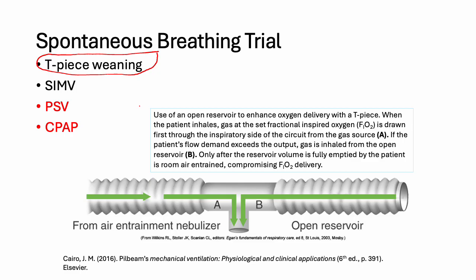In the last 5 years, I've probably only seen one used, and it was really for a patient who had been in the ICU for a very long time and had difficulty weaning. So what the team will do is remove the patient from the ventilator, and then this part will be placed on the endotracheal tube.